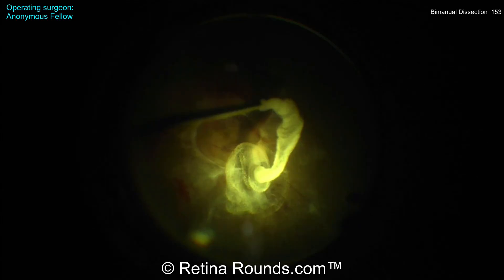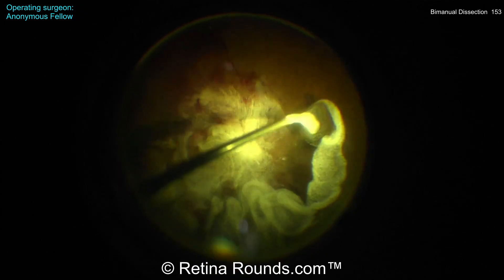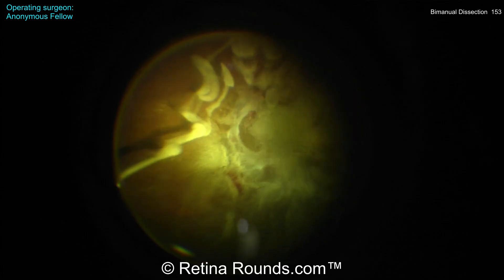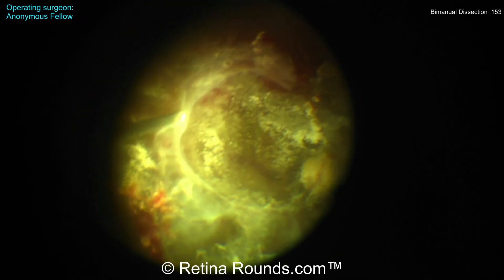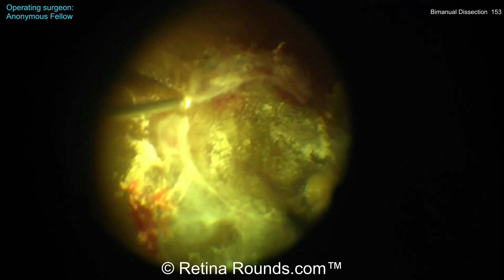In these cases, using some dilute triamcinolone, as is being demonstrated here, can be helpful to better see where the residual vitreous is and to make sure that dissection is taking place in the correct plane. Now you can see there is a space here in the temporal macula.